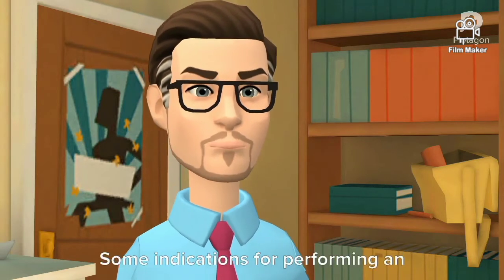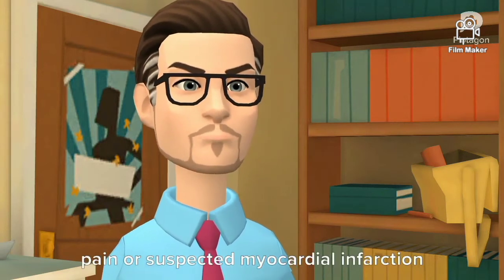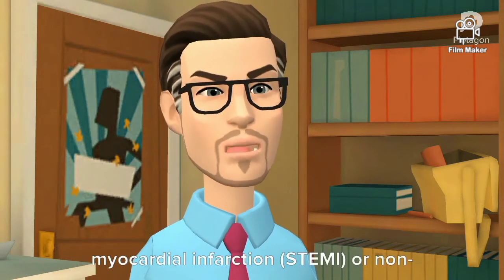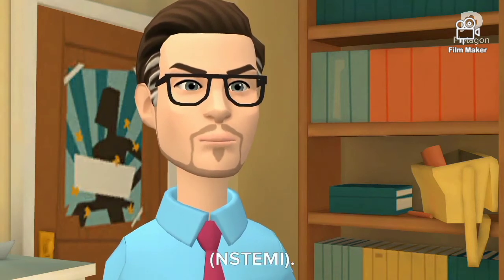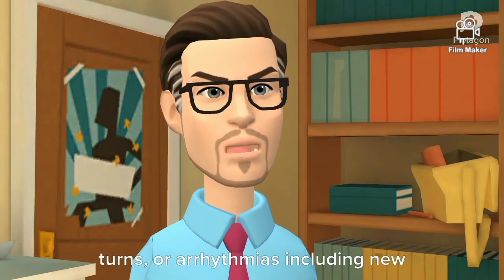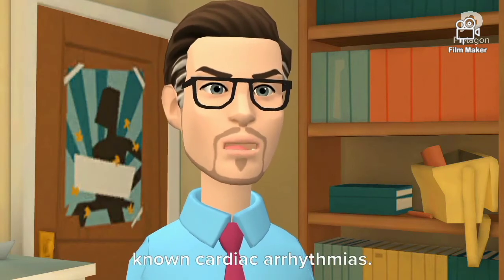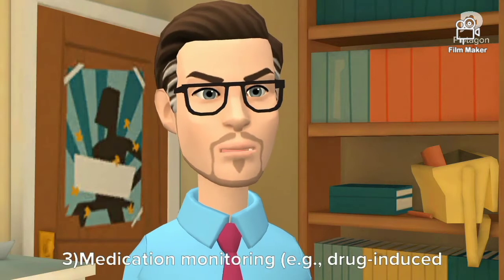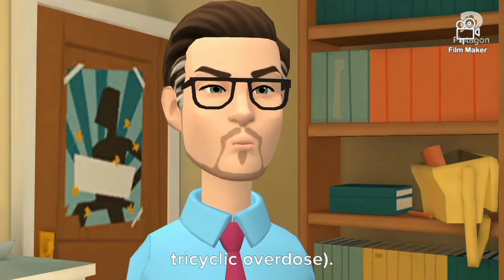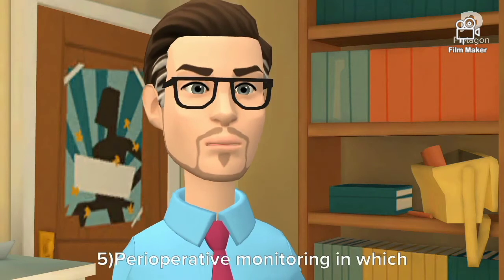Some indications for performing an ECG include the following: 1. Chest pain or suspected myocardial infarction, heart attack, such as ST elevated myocardial infarction, STEMI, or non-ST elevated myocardial infarction, NSTEMI. 2. Symptoms such as shortness of breath, murmurs, fainting, seizures, funny turns, or arrhythmias, including new onset palpitations or monitoring of known cardiac arrhythmias. 3. Medication monitoring, e.g., drug-induced QT prolongation, digoxin toxicity, and management of overdose, e.g., tricyclic overdose. 4. Electrolyte abnormalities, such as hyperkalemia.